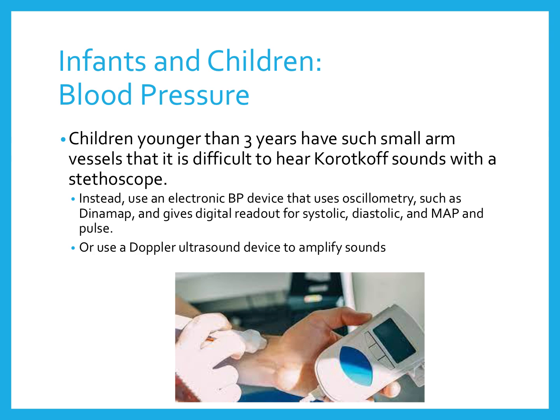So we like to use electronic blood pressure cuffs for children younger than 3 because it's just quicker and it gives us an accurate reading, because of the movement and how small children are. Or you can use a Doppler to help get those readings.